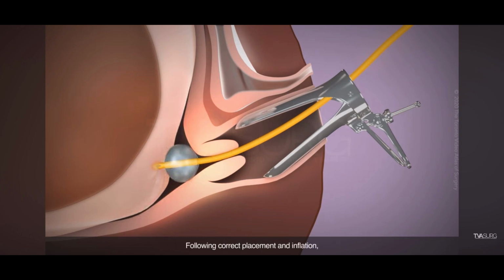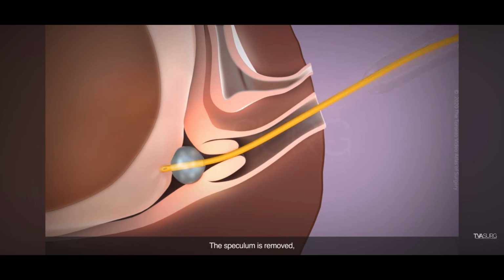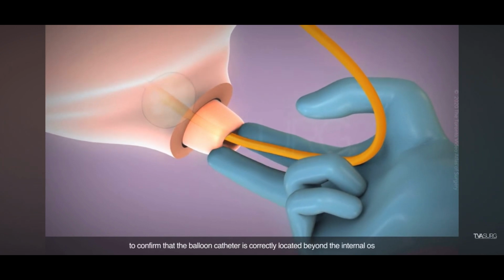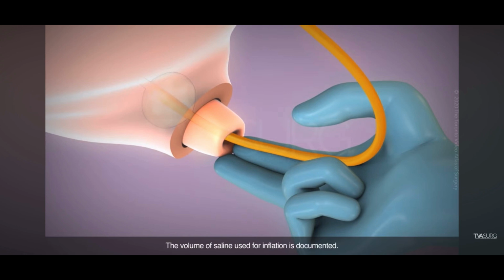Following correct placement and inflation, the balloon is then pulled back to apply constant pressure to the internal os. The speculum is removed, and a bimanual examination is carried out to confirm that the balloon catheter is correctly located beyond the internal os and not within the cervical canal or intravaginally. The volume of saline used for inflation is documented.